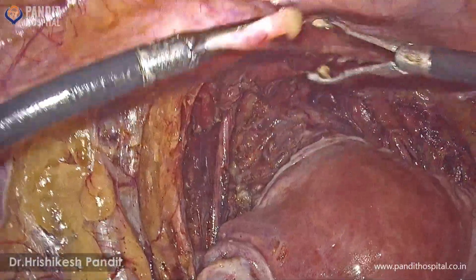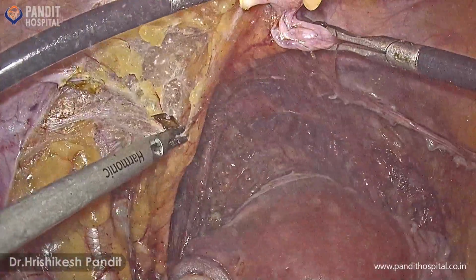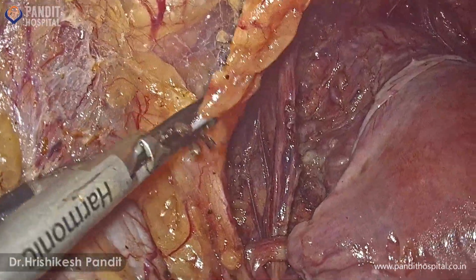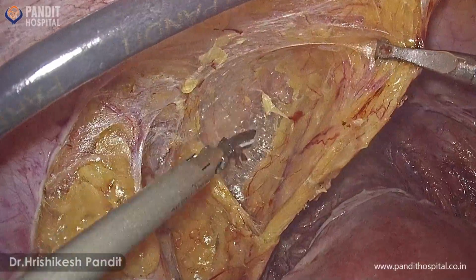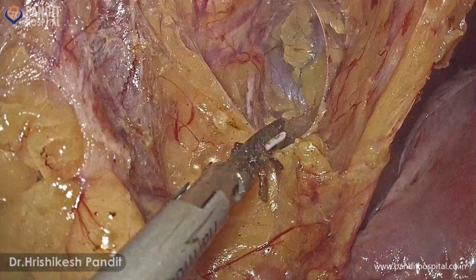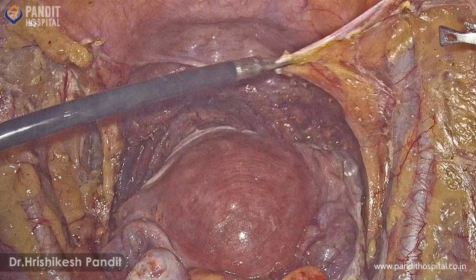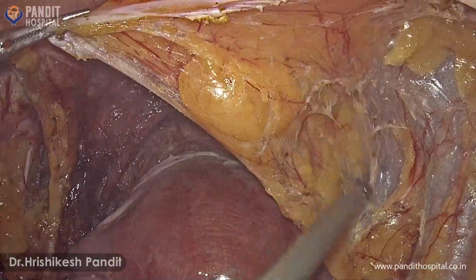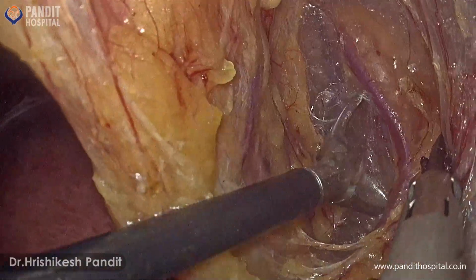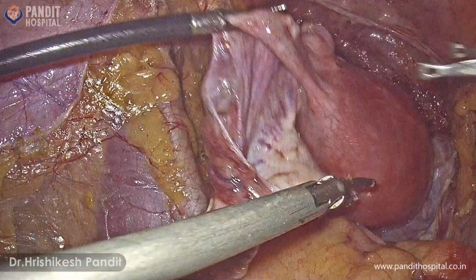Now we are retracting the obliterated umbilical artery medially, so we can dissect into the lateral paravesical space. Here we can see the obturator fossa with obturator nerve and vessels. Also we can see the left-sided corona mortis. Similarly on the right side, the obliterated umbilical artery is retracted medially, and we dissect in the lateral paravesical space to see the obturator nerve and vessels and the right-sided corona mortis.